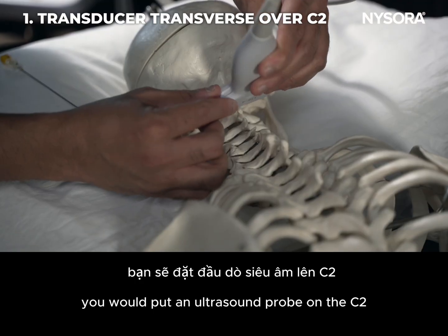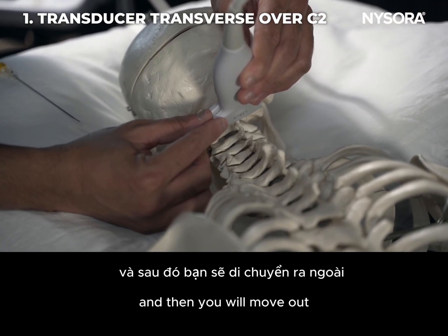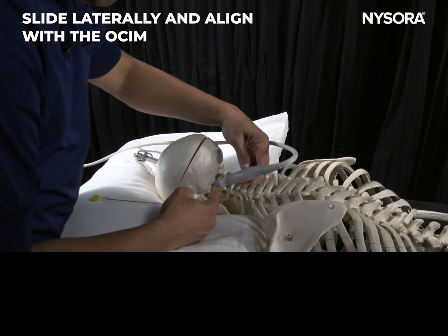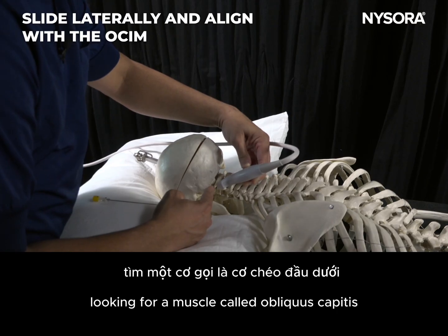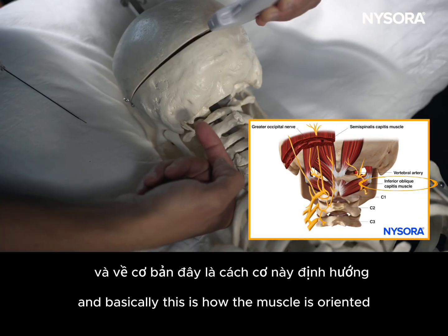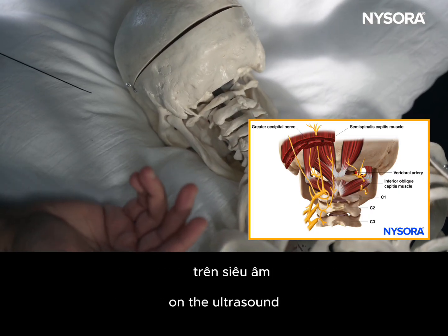You would put an ultrasound probe on the C2 and then you will move out and tilt the lateral end of the probe towards the mastoid process, looking for a muscle called obliquus capitis inferior muscle. And basically this is how the muscle is oriented, and it looks like a boat-shaped muscle on the ultrasound.